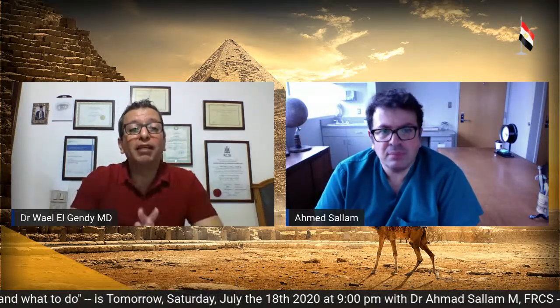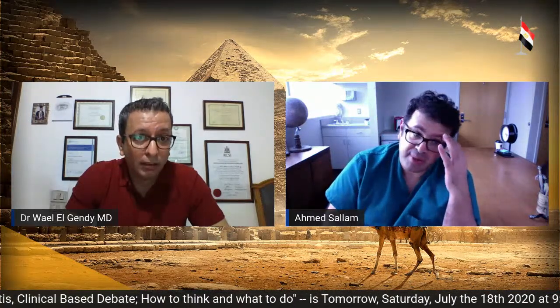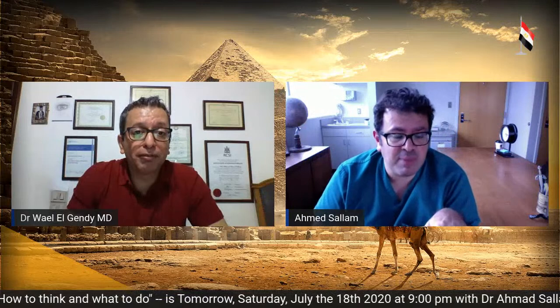So when you use the PFCL, Dr. Ahmed, do you fully fill the eye, or do you partially fill the eye, or again, across the tear and a bit? So you don't fully fill the eye? No, like what I showed, I cross the giant retinal tear and a bit more so that it covers the break. That's it. Oh, when I leave the PFCL tamponade? Yes. Oh, when I leave PFCL tamponade, yes, you want to really nearly fill the eye, so that you cannot see the edge.